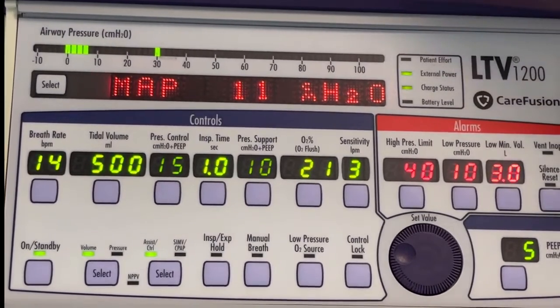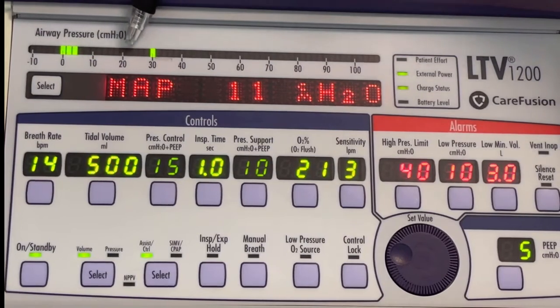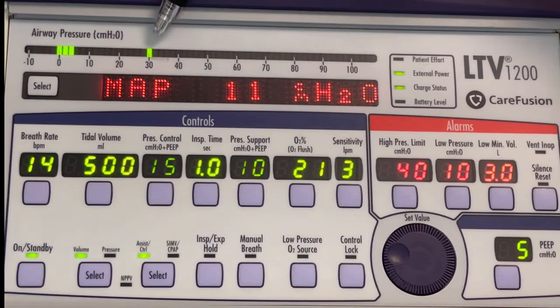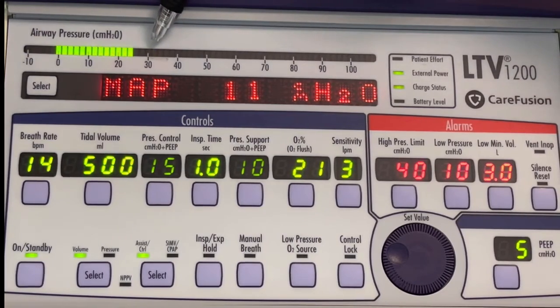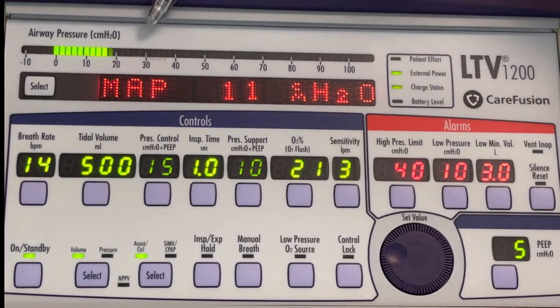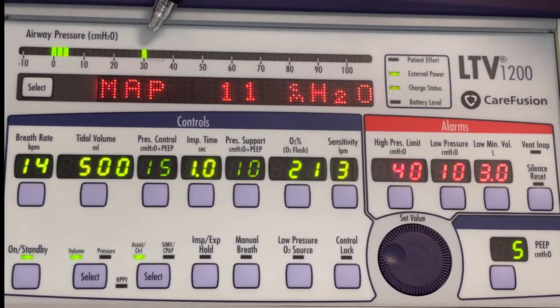And as you can see up here, it's going to say airway pressure, and you have this little highlighted bar that increases with each inspiration of the patient. And then it stops at a numerical value, which is at this time 30, which is just telling us that's our peak airway pressure. So that's what this continuous bar is going to show us here.